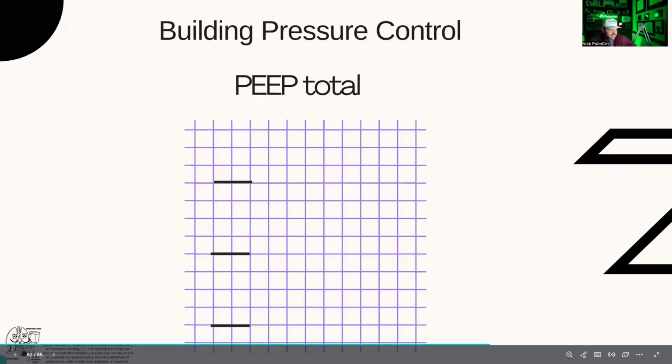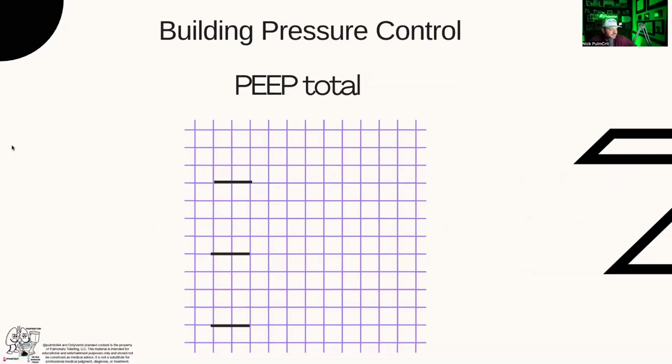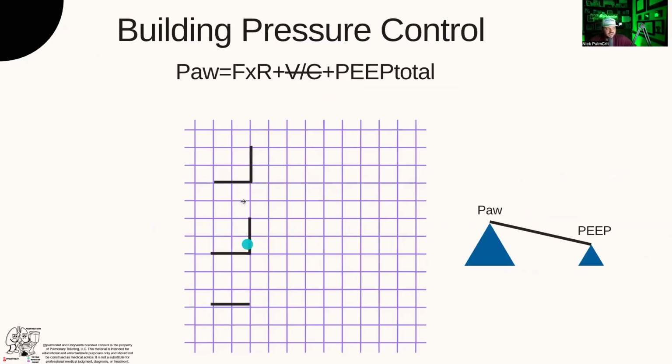Okay, so building it, and this is from the first webinar on pressure control. This is at PEEP. You can say PEEP 5 or whatever your heart desires. Then you cycle into inspiration. You have a trigger, either flow, pressure, or time, something triggers the ventilator initially. So you get this burst of pressure. This isn't exact because there's a little bit of a delay because of the ramp, etc. But for simplicity's sake, you go from 5 to a total of 20.